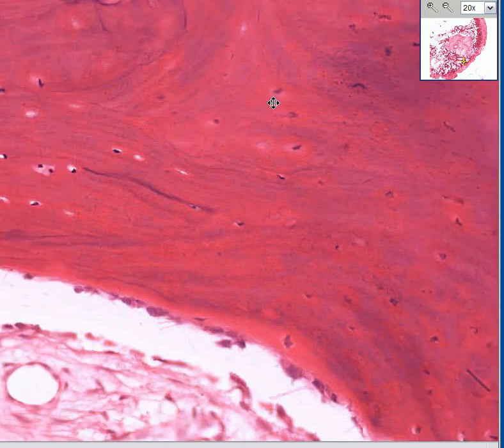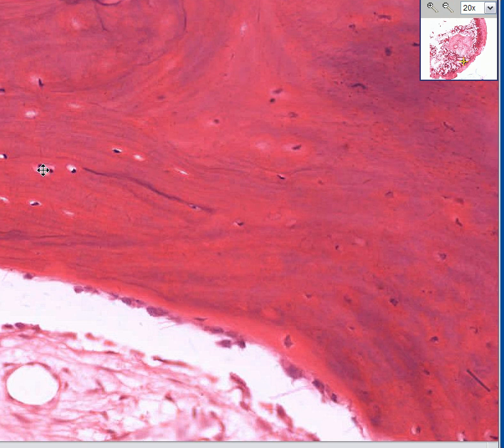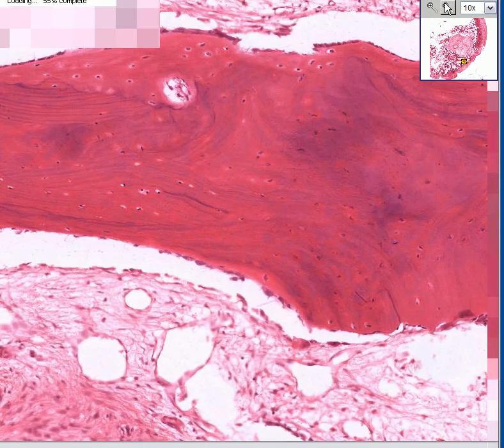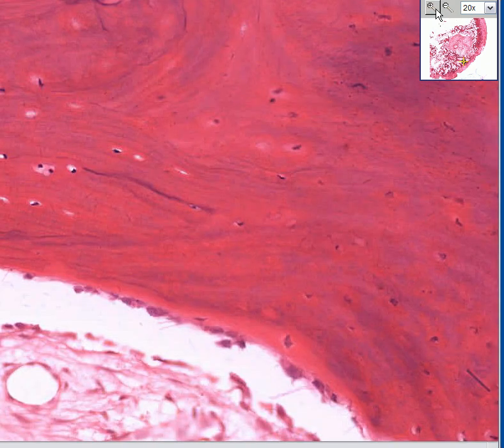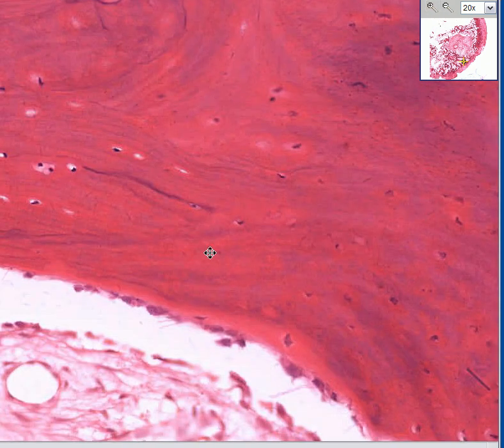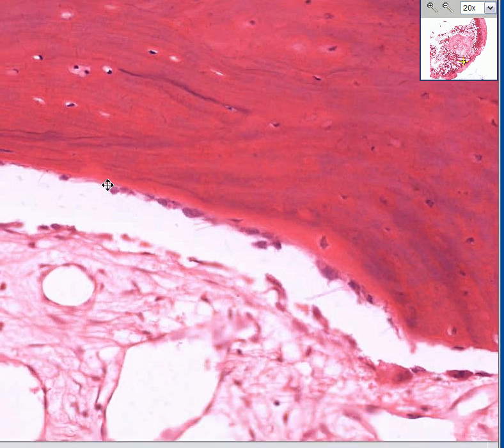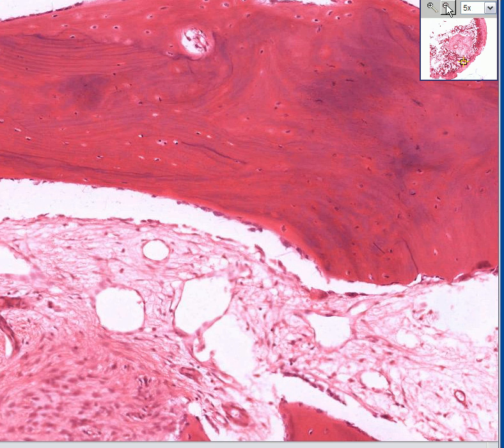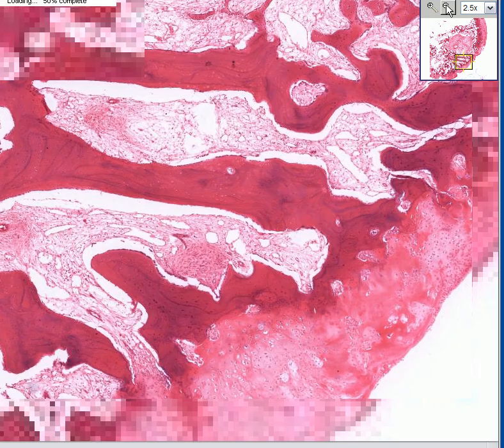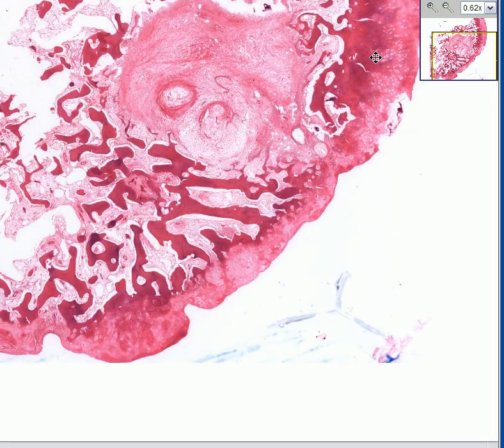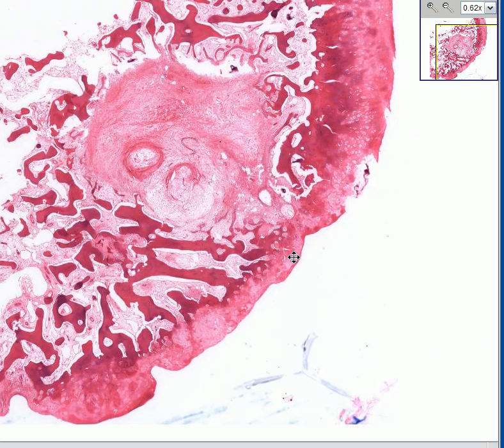Here are several lacunae with osteocytes. You can see the nice peripheral rim of osteoblasts, and then the connective tissue between the spicules, which is predominantly loose fibrous connective tissue.